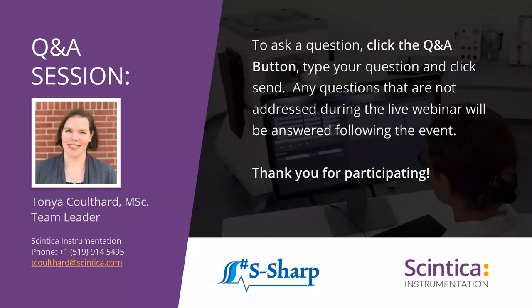And again, you can increase that if you want the acquisition to be faster and you're not as concerned about the out-of-plane resolution. But again, that's going to take multiple B-mode images in 2 dimensions and stack them back together. I like to think of it as like my loaf of bread. I've got my different slices, and when I stack them all back together, it looks like the entire loaf, which I can then reslice in any orientation that I want as I view that image within the visualization software.